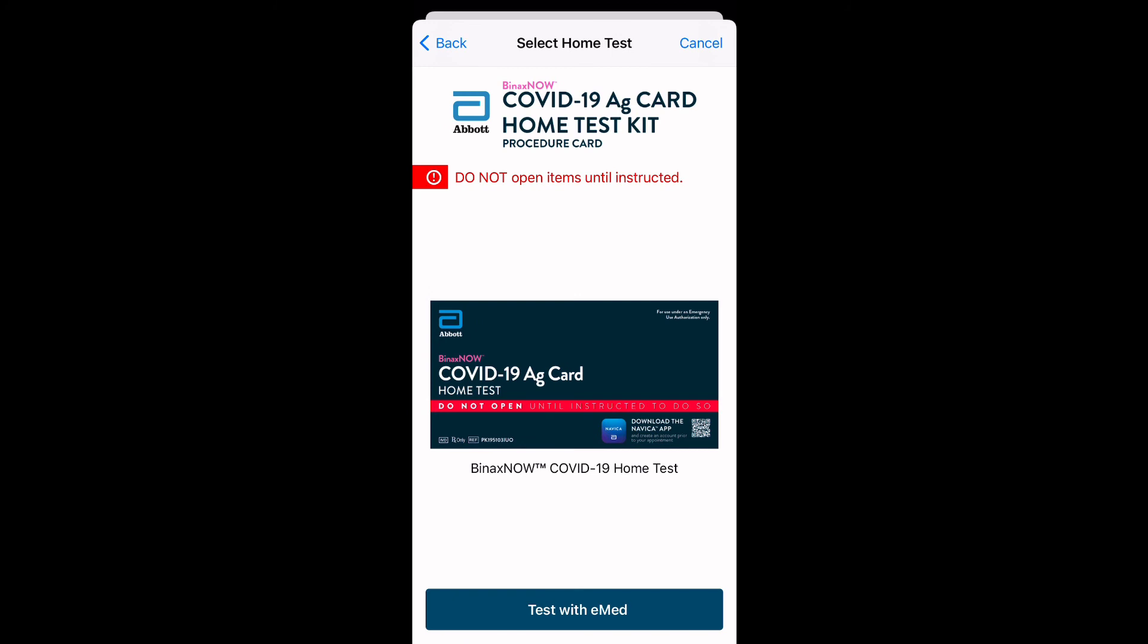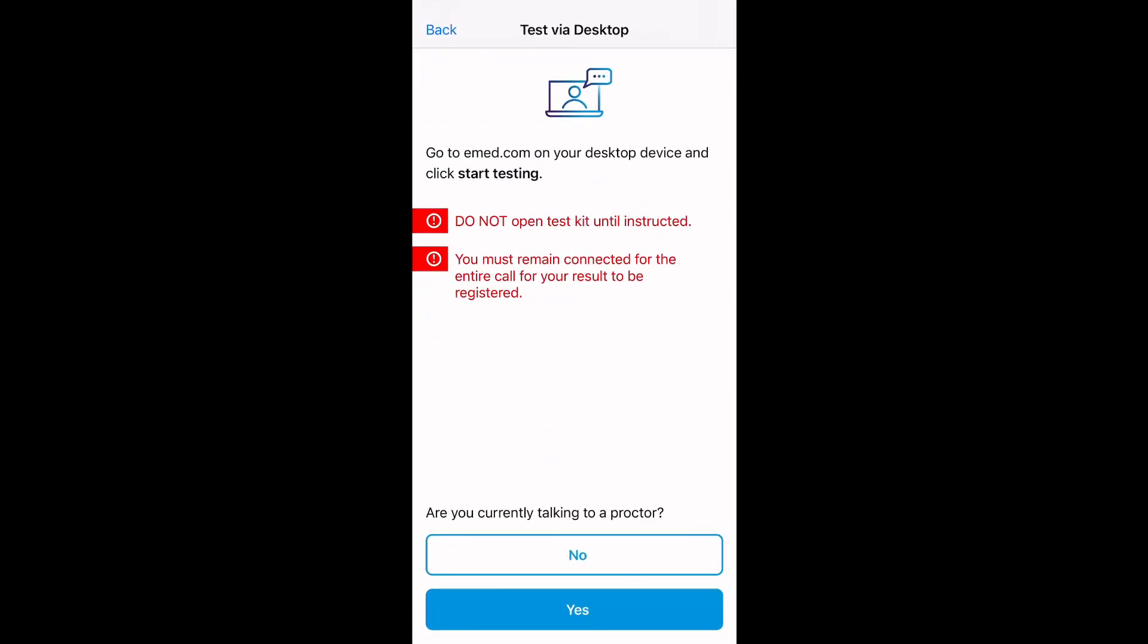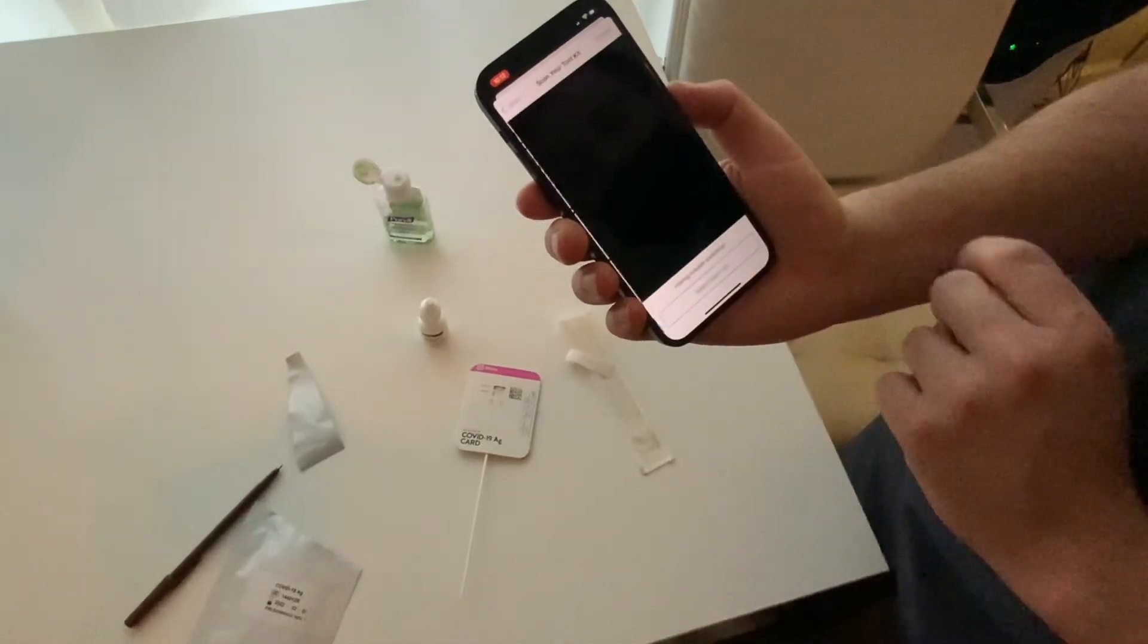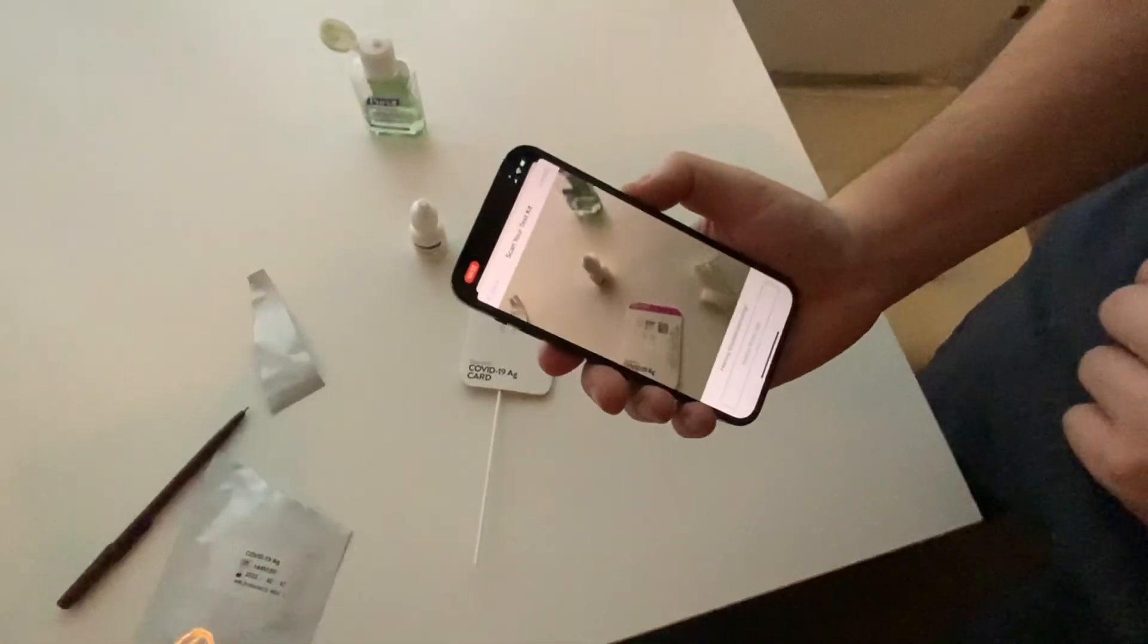And you can choose which one, of course. And it's really quite easy. Basically, you're just going to scan after you put your information in and you have your digital wallet there for your results. And that's pretty much it.